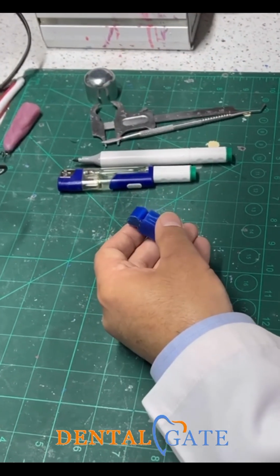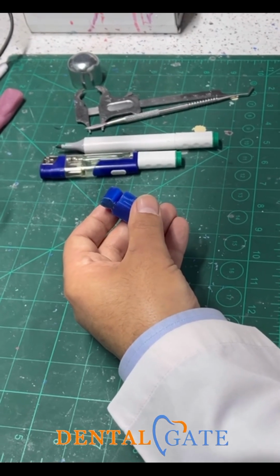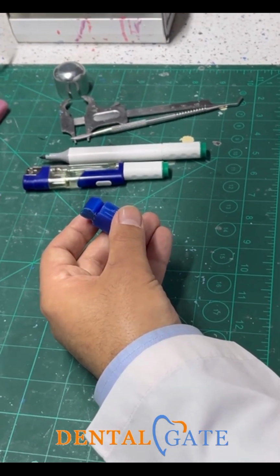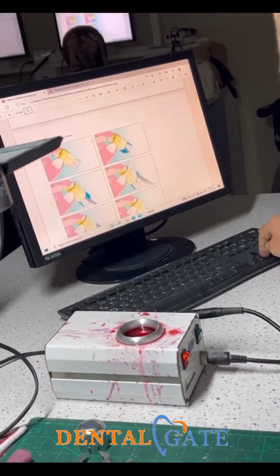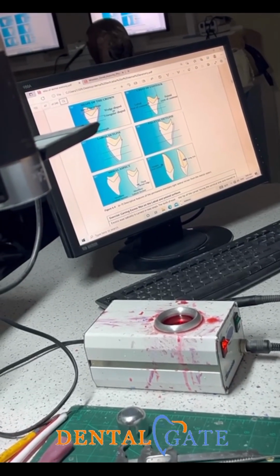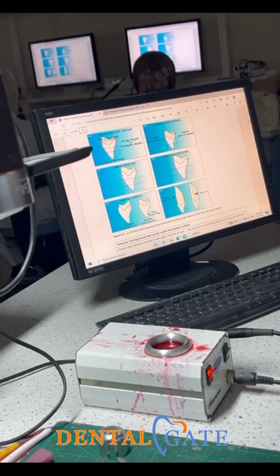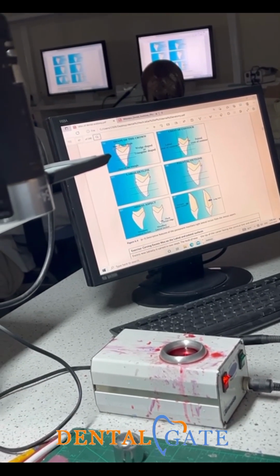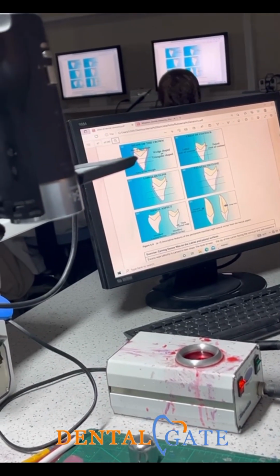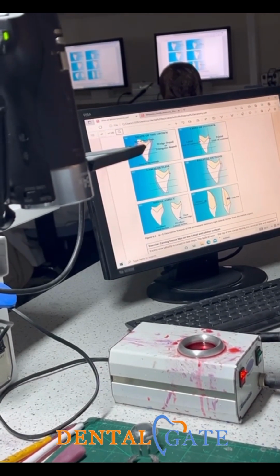So, as I am a student, I will start with the distal aspect. For the distal aspect, I will go to my reference. So I accomplished this stage, and I will go to the other slide. You can see this is the distal aspect or the mesial aspect. This is a triangular shape, but we have a curve here. You have a maximum convexity at the cervical third, as in the central incisor. And we have a curve toward the incisal edge.